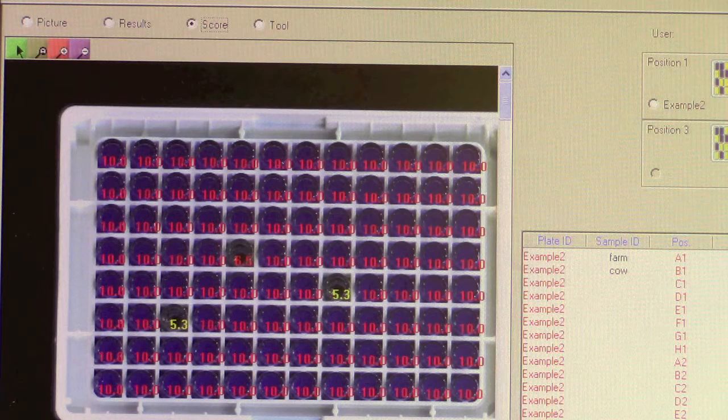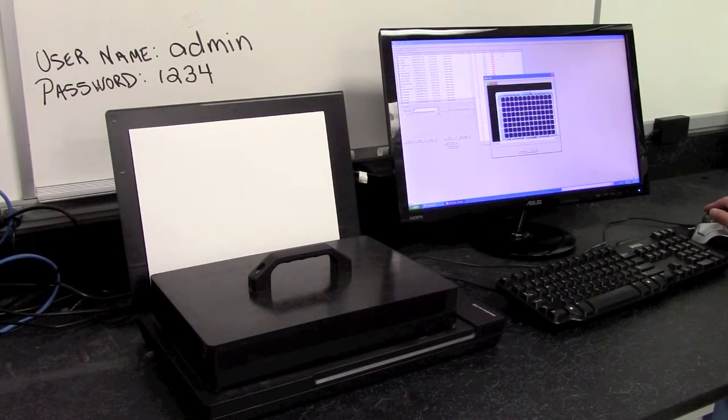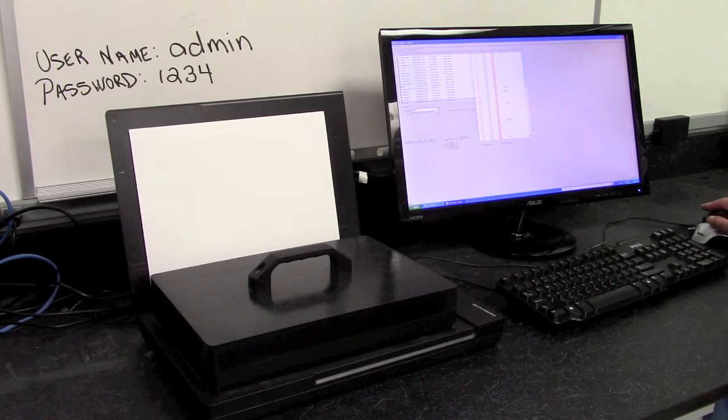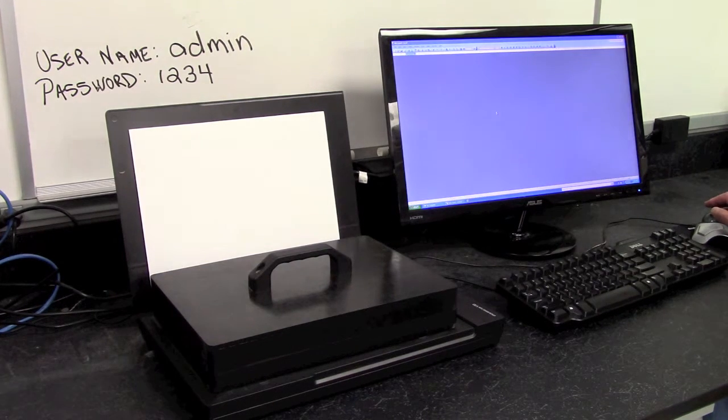At the bottom of the screen, you can save the image of your plate, you can save your results to a separate file on your computer, or the archive feature. You can pull up any test result that you have, and you can search based on date or plate identification. And this is the plate that we just ran. We can, again, save the image, or we have an option where we can export the test results in an Excel file. So I'm going to save this particular plate results onto my desktop and put in whatever name you want, save it.